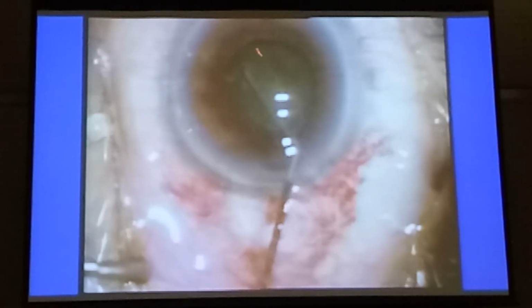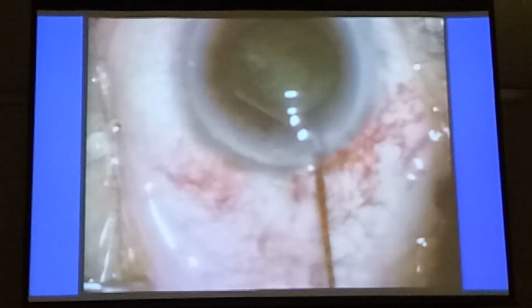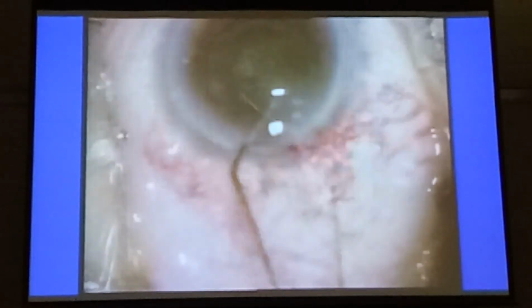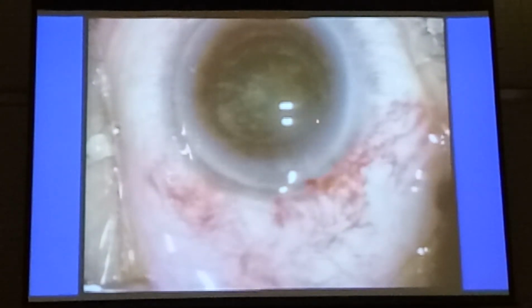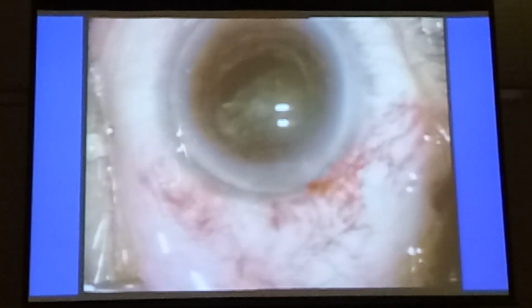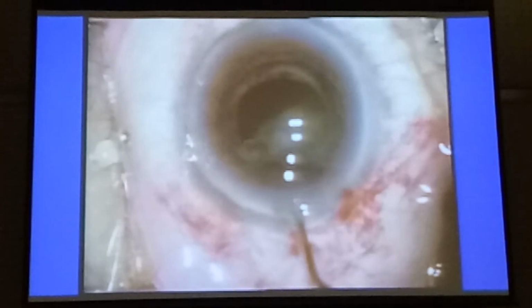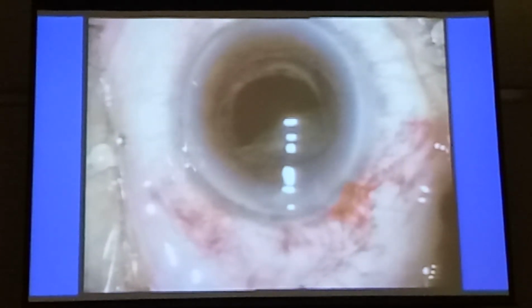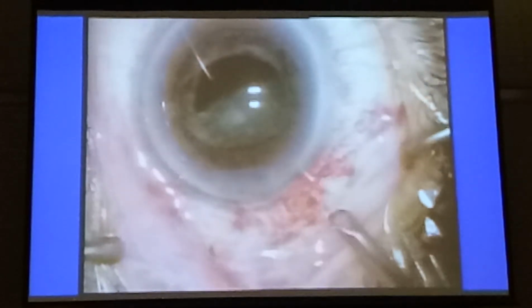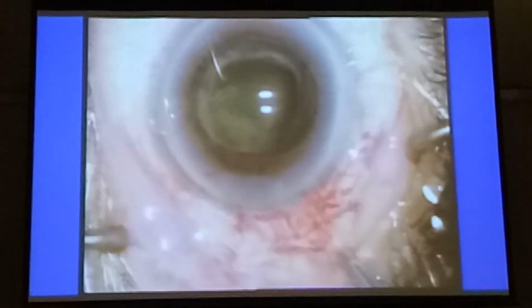Let's just show you another case. Hydrodissection. That's quite obvious. I think this is your case right there. So you were taking a residence through or something some years ago. And again, when this happens, you don't believe something happened. When I first submitted this paper, one reviewer said this is rubbish, nonsense. I've never seen it before, so it doesn't exist. Reject. Luckily, there's a second reviewer who said publish it immediately. So it's now established that this is a condition that happens.